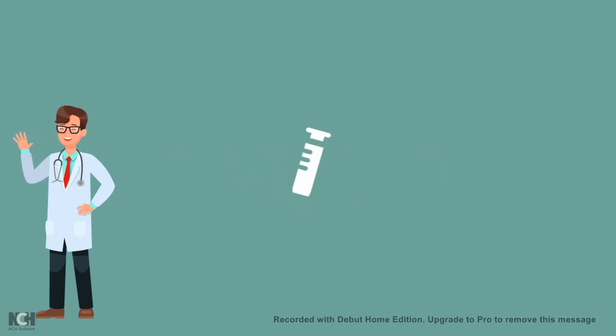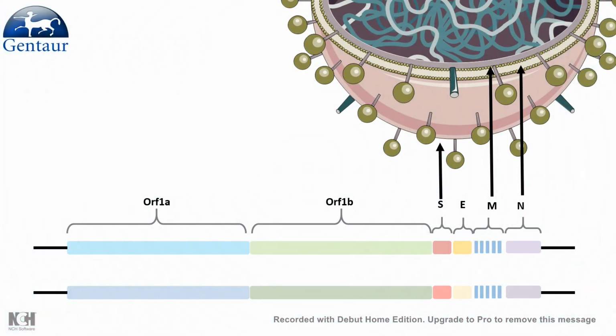So when you go to the clinic and if the doctor suspects that you are affected by the virus, he would ask you to do a test which is called real-time PCR test from your blood samples or your sputum samples. But before that, let us understand what they would actually check.